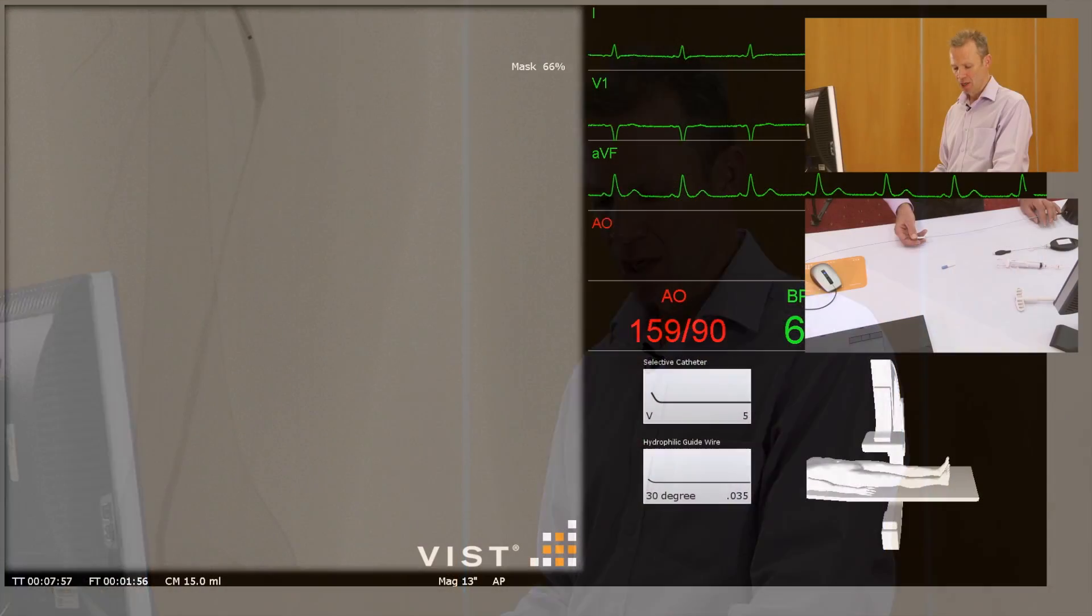Hi, my name is Phil Haslam. I'm an interventional radiologist and what I'd like to show you is how to do an SFA stenting through a relatively tight distal SFA stenosis.